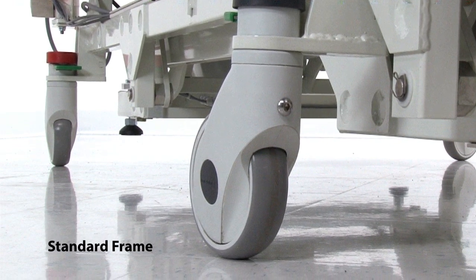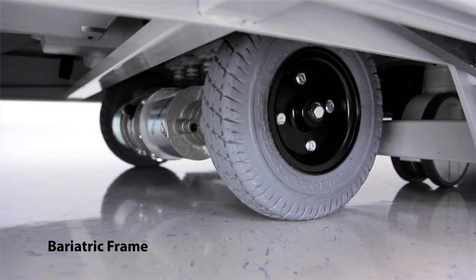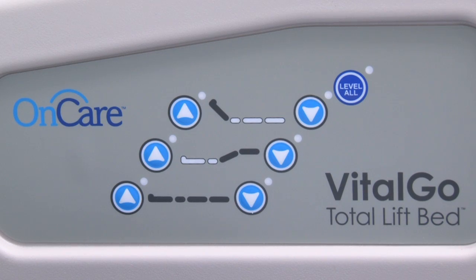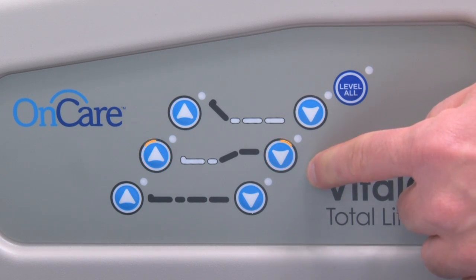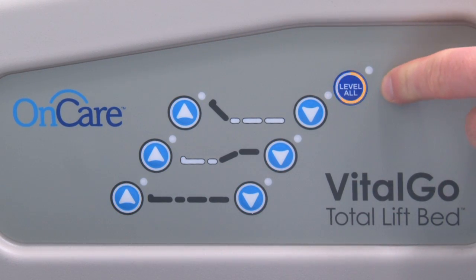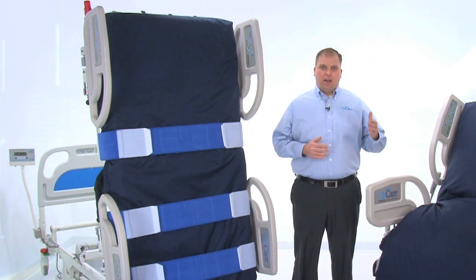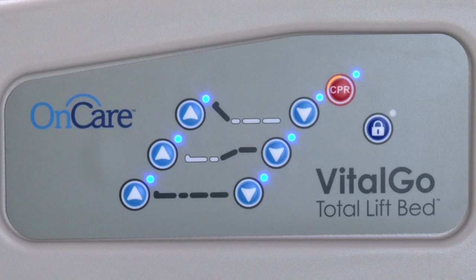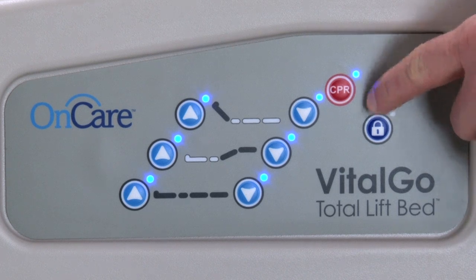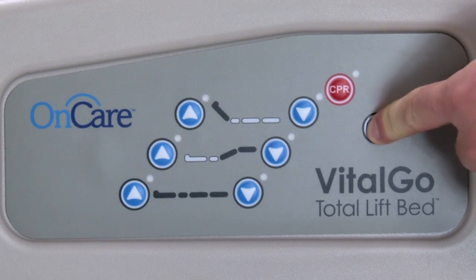While both beds include casters for transport, the bariatric bed features an optional motorized drive system. Patient controls are conveniently located on the inside of the head-end side rails and include head up and down, foot up and down, bed up and down, and level all. The caregiver controls located on the outside of the head-end side rails offer the same functionality as the patient controls with the addition of a CPR button and lockout control.